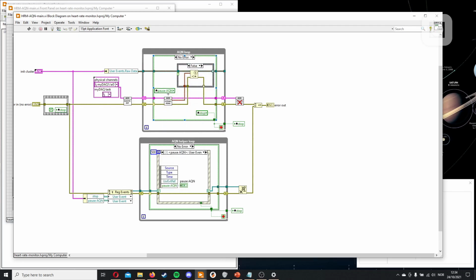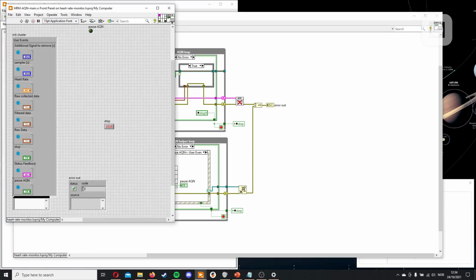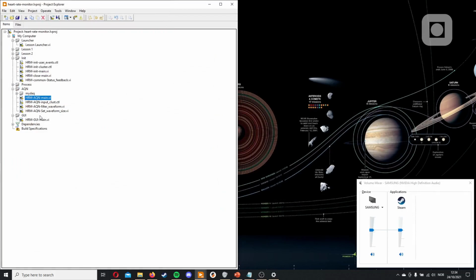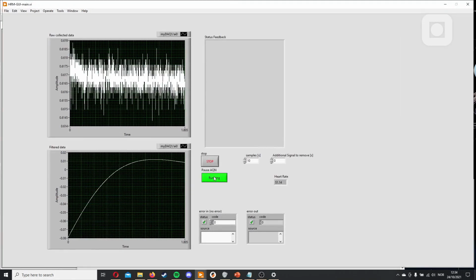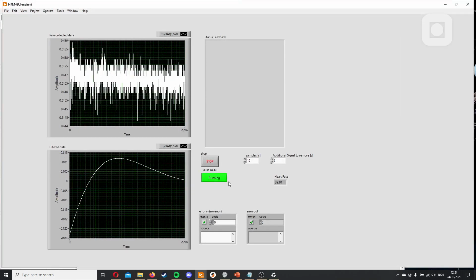Change to read. We could drag this down so the error wire is clear, but then it would block for this one. So I'll just keep it up here. Let's test the functionality now. Running, and then it stopped. As you see, it went back to where we wanted it, and now we can never get it running again.